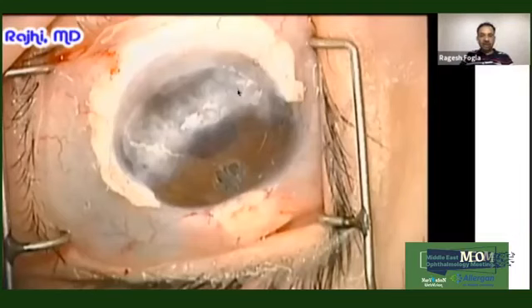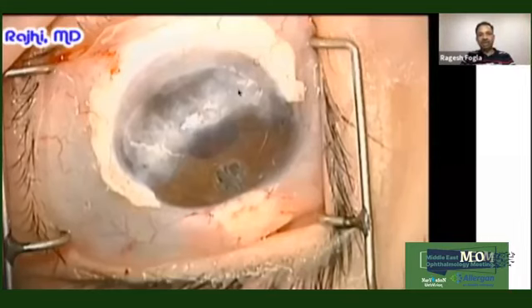Then use alcohol to debride the epithelium. And once you have cleared the entire epithelium, you take a large diameter corneoscleral graft. You have to fashion it manually, with at least 1.5 millimeter rim of sclera all around. This can be placed on top of the cornea, and then you can suture it at the episclera. You can use a combination of sutures and fibrin glue to secure it at the periphery, and then you close the conjunctiva on top. And by doing that, you achieve a normal corneal thickness.